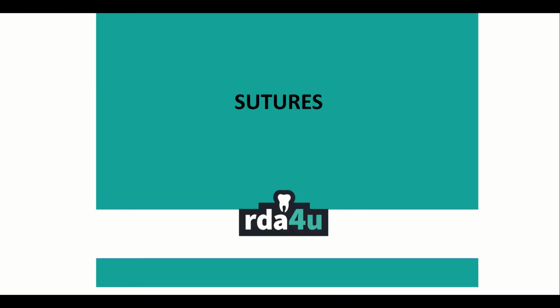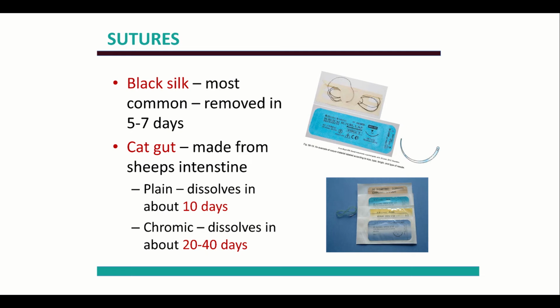Once we're done with all of that and we've extracted the teeth, used the rongeur and file, and cleaned out the socket, we are ready to place sutures. There are basically two different types of sutures. There's what is called black silk suture that is actually made out of silk, and of course they're attached to the metal needle here, and it does not dissolve.